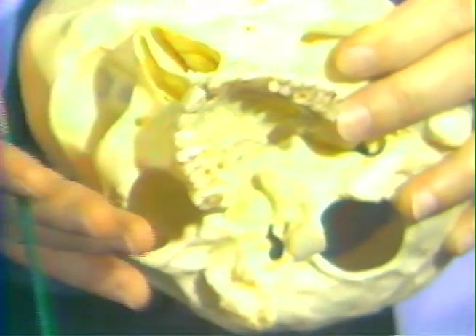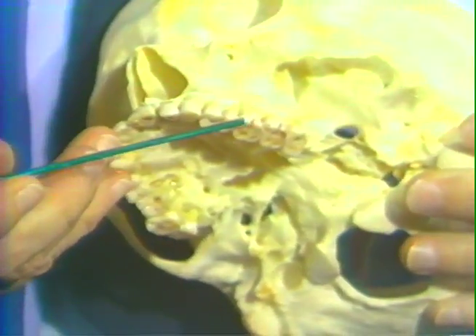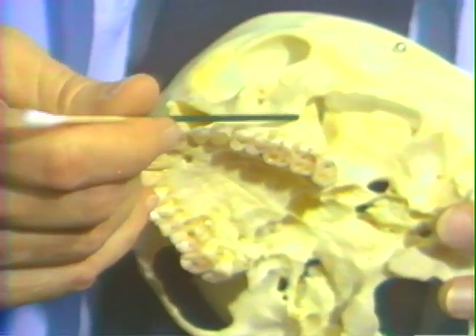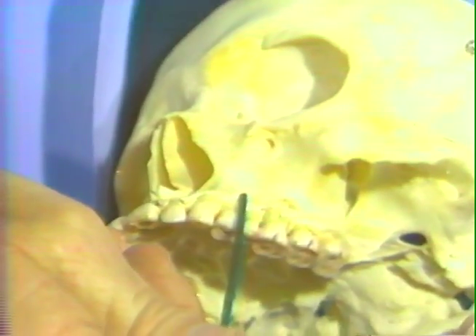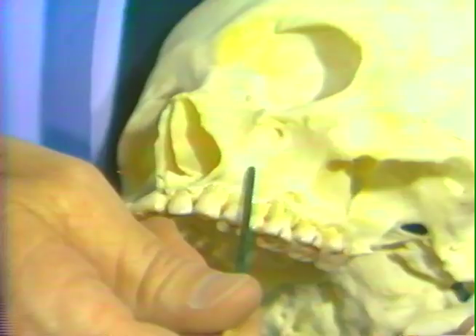These landmarks can now be demonstrated. The anatomical skull. Once again, the upper left posterior superior alveolar nerve, with the needle passing posterior to the zygomatic process of the maxilla, parallel to the tuberosity. For the middle superior alveolar nerve, passing in the axial direction of the bicuspid teeth to the height equal to the apical area of the tooth.